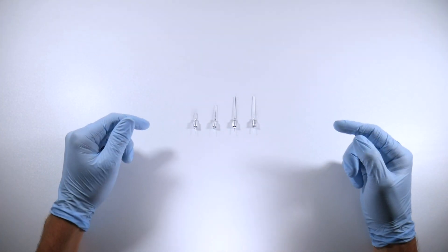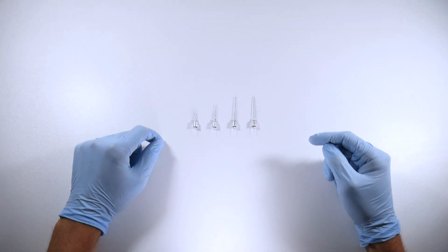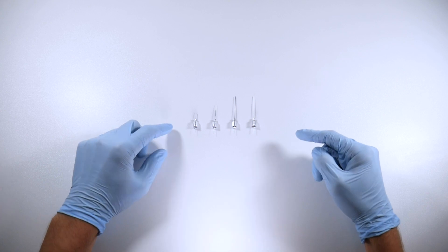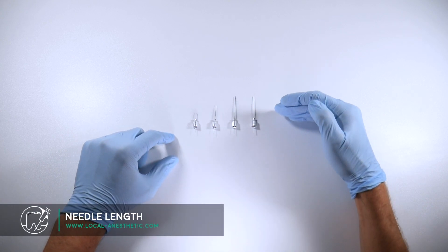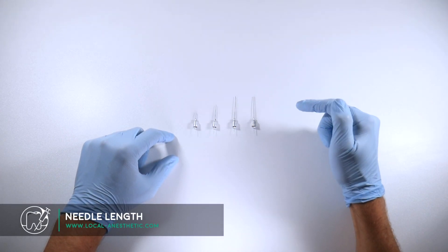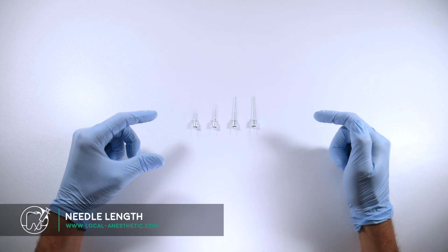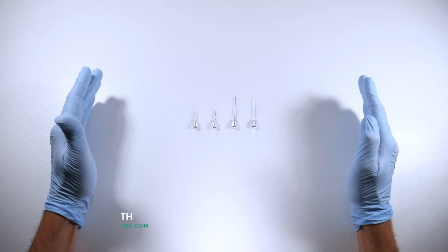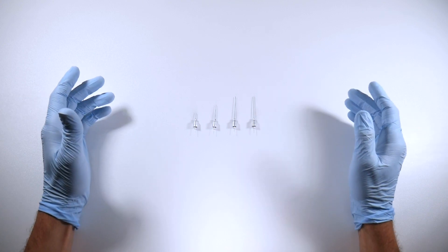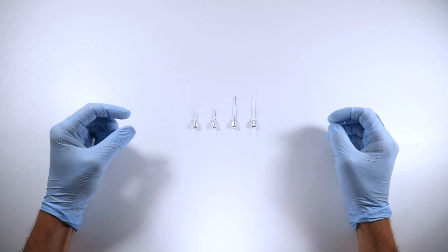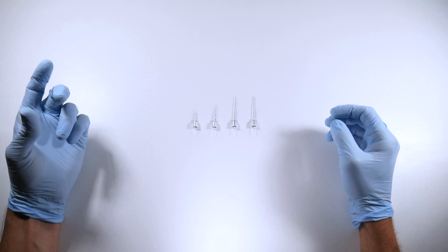One of the things we're going to want to look at with our armamentarium is the type of needle that we're using. Needles come in all different lengths, and that's specifically what this video is going to be about - the length of the needle. Some practitioners will say, 'I only use short needles, that's the only thing I use. I use the smaller gauge 30 short.'